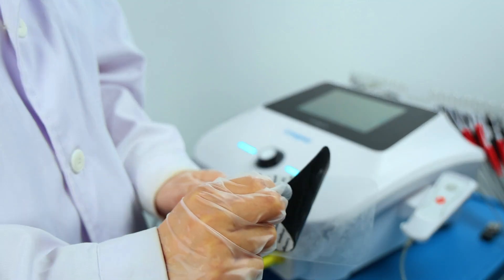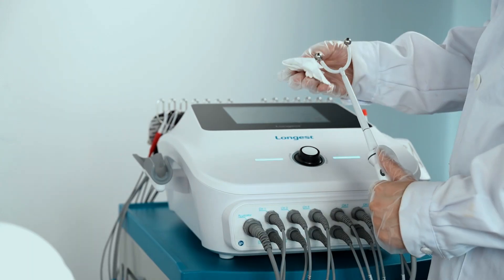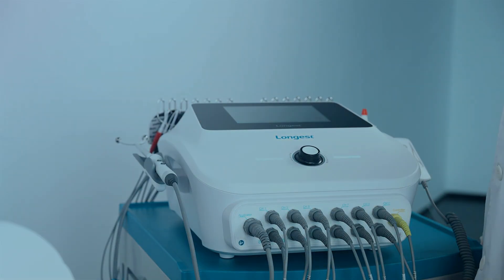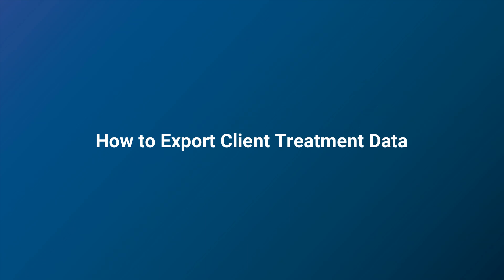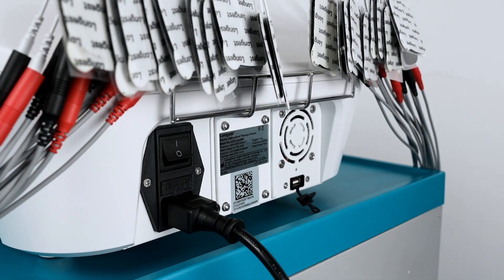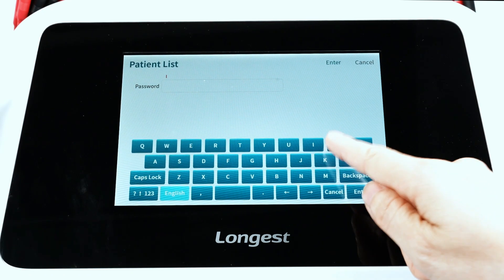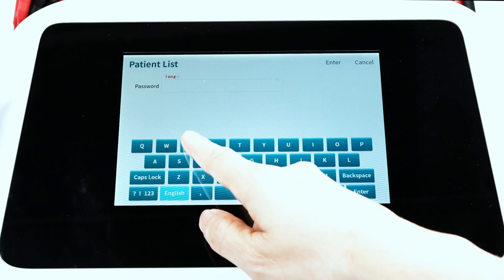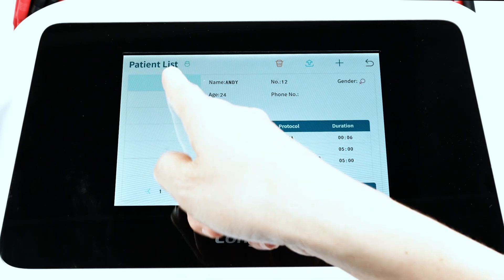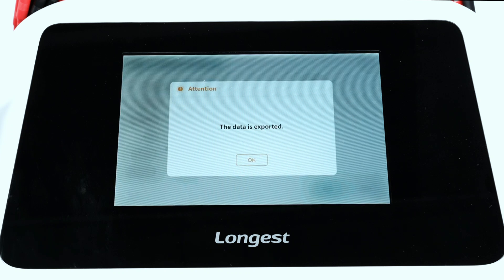Carefully remove the electrode and clean the client's skin and the applicator to remove any remaining gel. The client treatment data can be exported — insert the USB into the USB port on the back side of the machine. Then click the patient list and enter the password. Choose the client profile and press the export button. Wait a few seconds to export the profile to the USB.